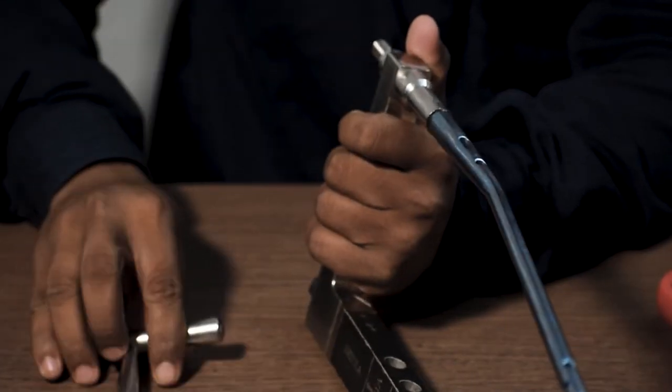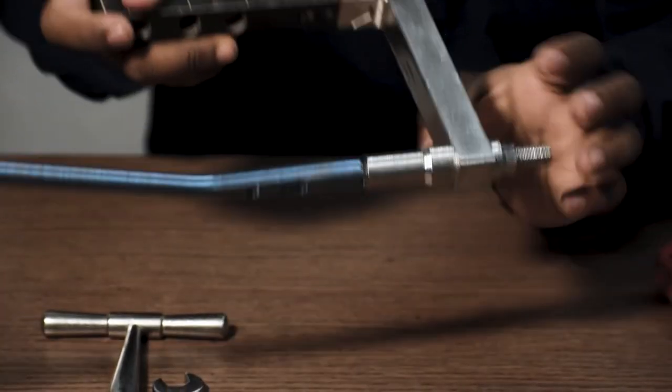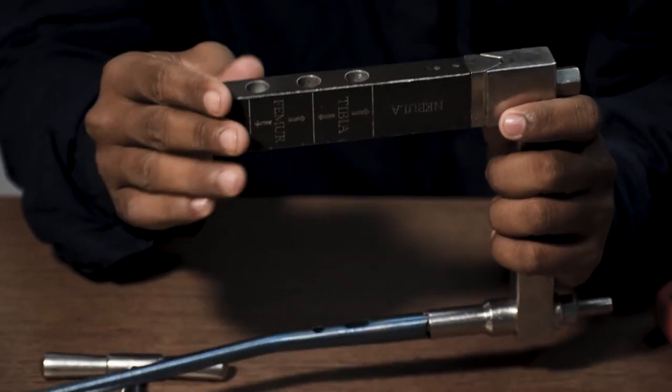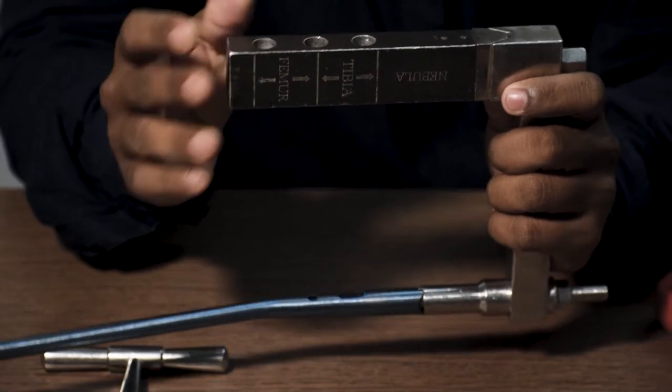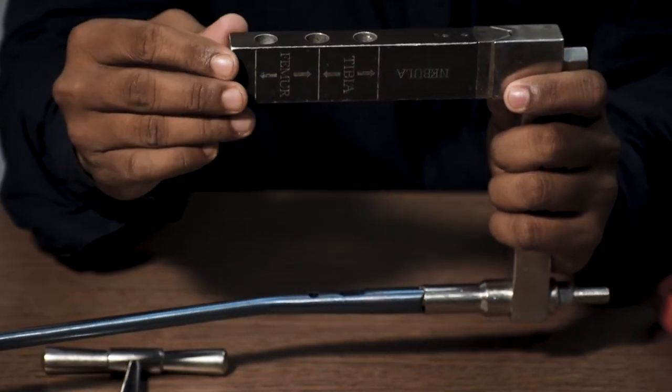The jig must be always tested before using it in the operation so that it does not create any problem during the operation.